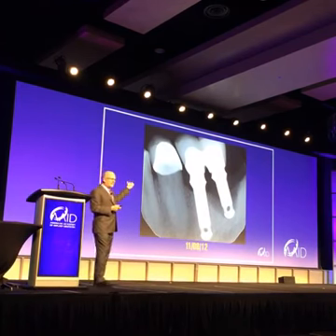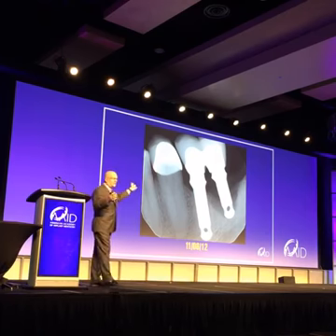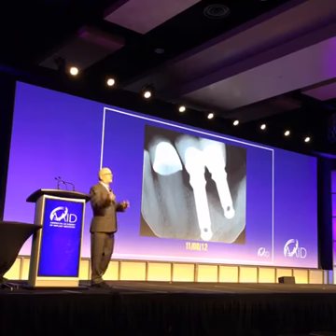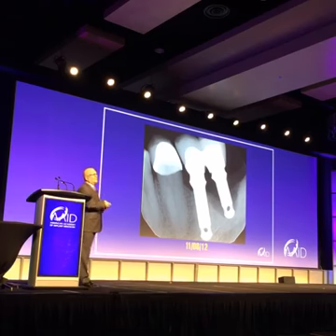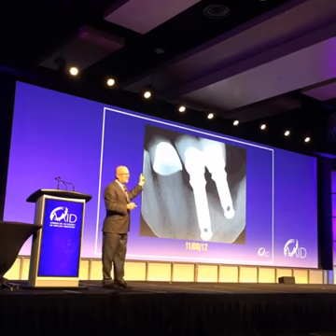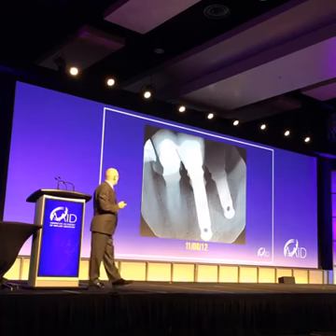What about this case here? How many here would take that implant out? I told the guy, you're going to lose this. He said, well, my doctor sent me to you. I said, look, I'll give it a shot. If it doesn't work, I'll apply whatever you pay to the cost of taking this out and grafting it, etc. I'm not real happy with the restoration, which was done by his best friend in New York City. And I said, tell him to find a new best friend, because that's not right. I don't care what you tell him.